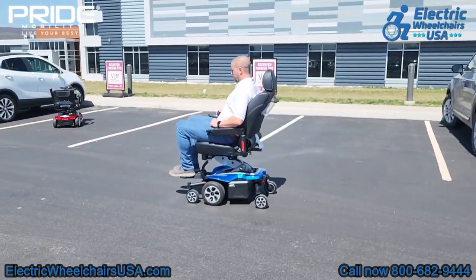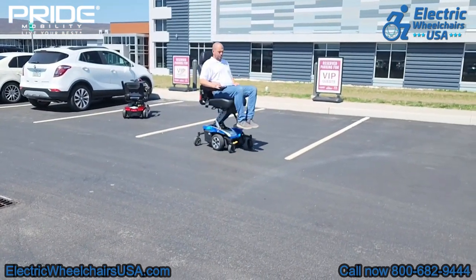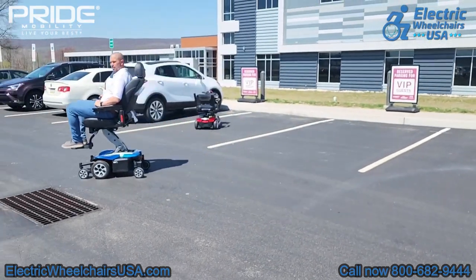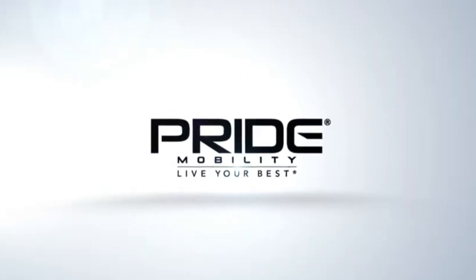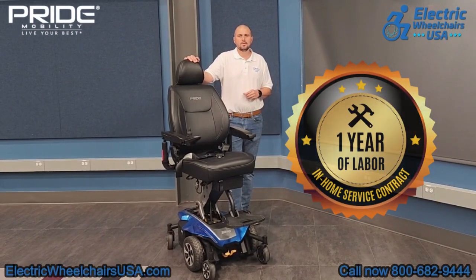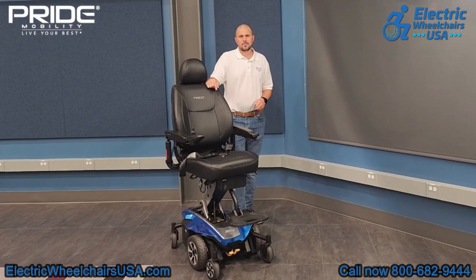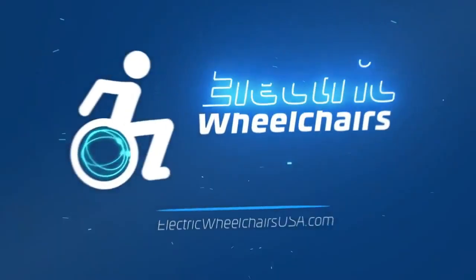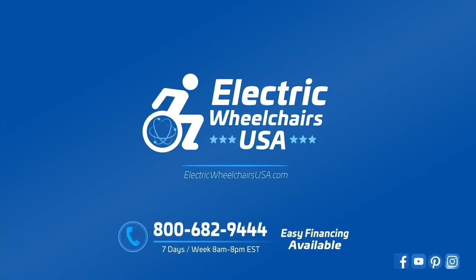In conclusion, if you're looking for a power wheelchair with a power elevating seat that can hold up to 300 pounds and raise up to 12 inches in height, we definitely recommend the Jazzy Air 2. Pride Mobility is one of the best brands in the mobility industry. They also have one of the best warranties, which includes one year of in-home service — they'll dispatch a technician to your home to diagnose and resolve any issue within the first year, as long as it's a warranty-approved claim. For questions, call us at 1-800-682-9444 or visit electricwheelchairsusa.com.